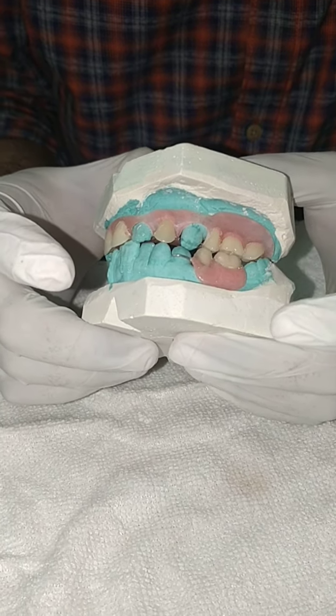This is the flexible partial I have made for them. You can check the flexibility, and this is how it is attached with the gums — you can see the seating.